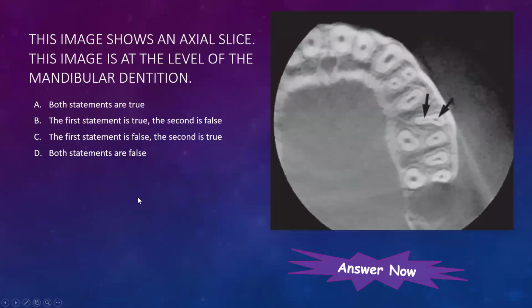All right, I didn't go much into interpretation, but would you guys be able to tell this? What do you think of this? Is this a maxillary slice or mandibular? It's maxillary. You're looking at a cross section of, this is the mesiobuccal root of a first molar. This is a second premolar. This is a first premolar, which in most cases is going to have 2 roots. Second has 1. And then these are the 2 molars. So that's a maxillary one. Is it an axial slice? Yeah.